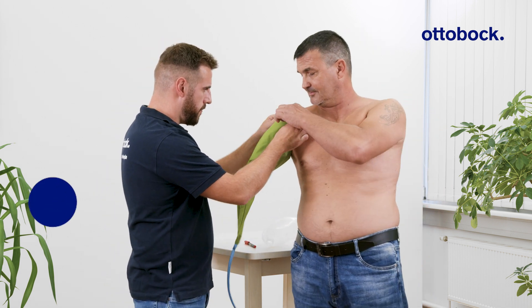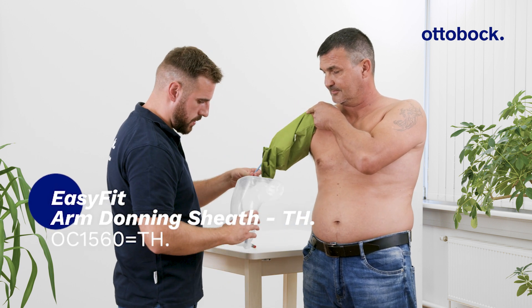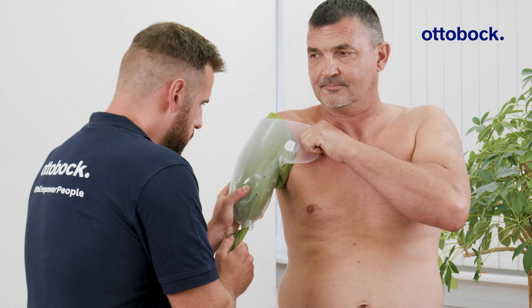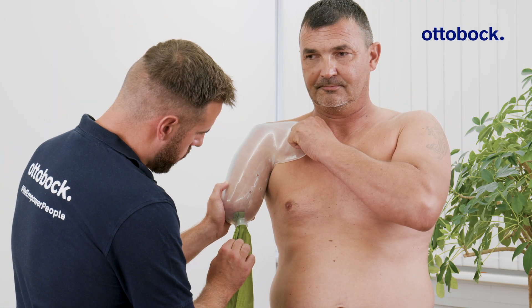Make sure to use the transhumeral EasyFit arm donning sheath whenever donning the socket. Take care to remove the donning sheath gently.